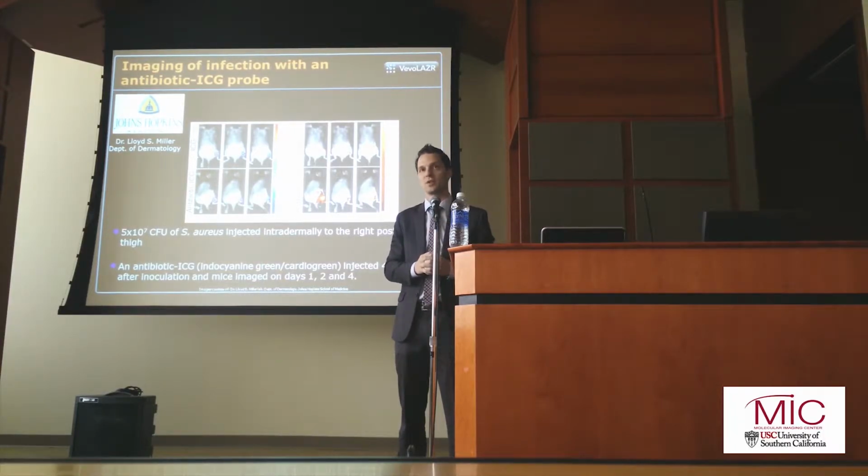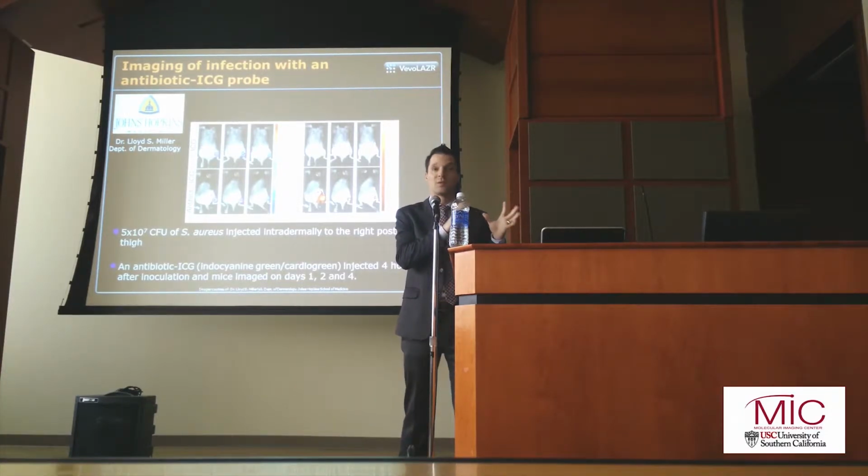Very, very difficult to treat. Often what they have to do is take the implant out, wash it, and put it back in. Obviously, there's a lot of problems associated with that. And they just wanted to be able to see, okay, can we image bacterial infection in some way, so we can have some way of seeing whether or not the infection is there.